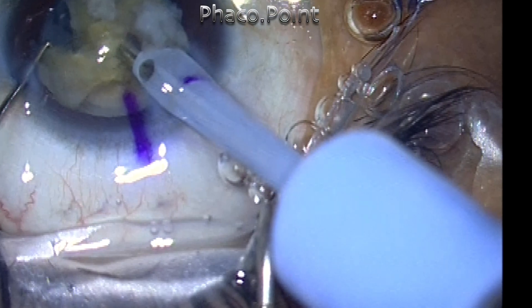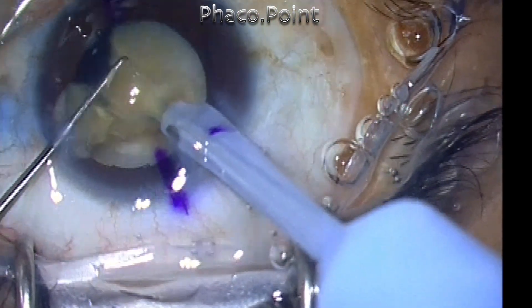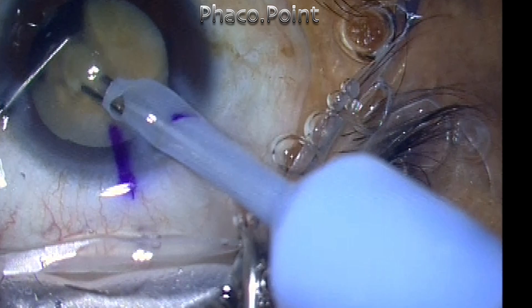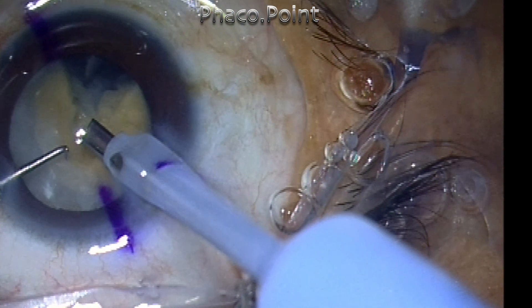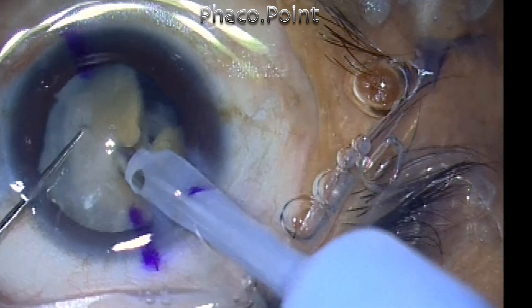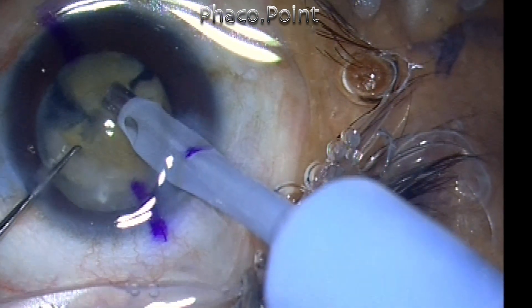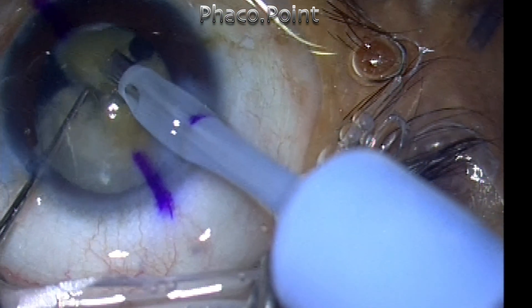I mobilize the fragments and break it down into smaller fragments. The trick is to break down the nucleus into as many small fragments as possible and then eat it up, because fragment creation does not require phaco power — you're using mechanical forces. It's only while eating up the pieces that you use phaco power. Therefore, by creating multiple small fragments, you're actually relying more on mechanical energy to break down the nucleus, and that is why I recommend breaking it down into multiple small pieces.